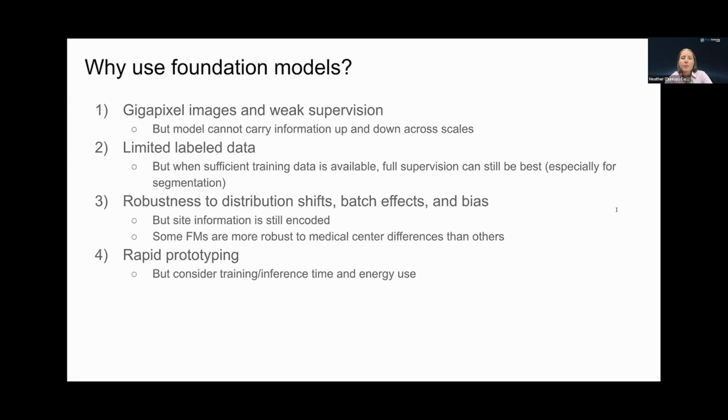And the fourth reason was if you want to rapidly prototype a model, you want to get up and running without all the work it takes to train a model to learn a representation for your data. And this, again, is a great reason for using a foundation model, but keep in mind the training and inference time and the energy use, especially if you've chosen the larger model.